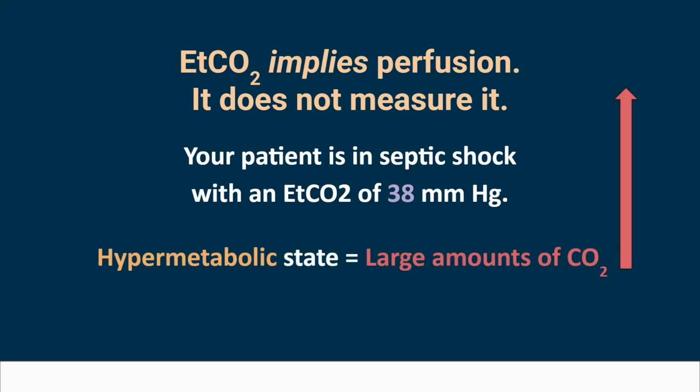Now, like I said, EtCO2 implies perfusion. It's not measuring it specifically. If you have a patient in septic shock with an end tidal of 38, you might be like, oh, okay, that's good perfusion. If you thought end tidal was only a marker for that, you would look at a 38 and be like, oh, thank God we can do end tidal, and know that this guy is perfusing just fine. Because he has a widespread inflammatory response, his body is in a hypermetabolic state. Or if you want to put a finer point on it, they're hot to the touch, they're febrile. That means their body's working hard.